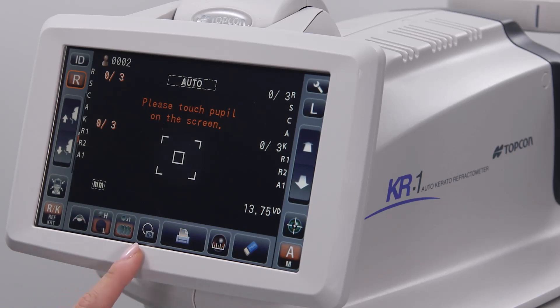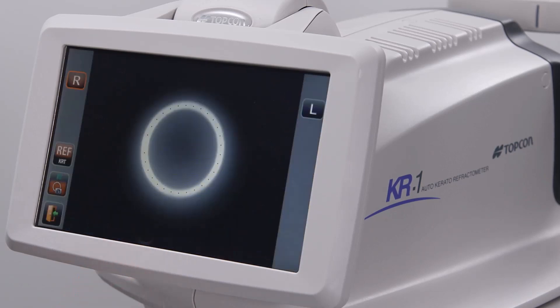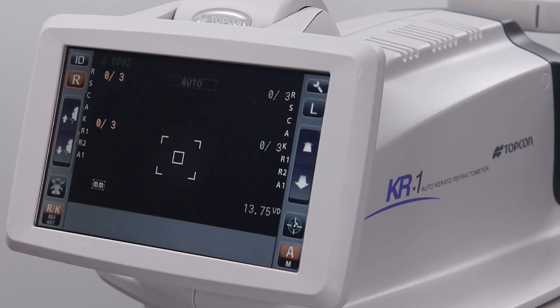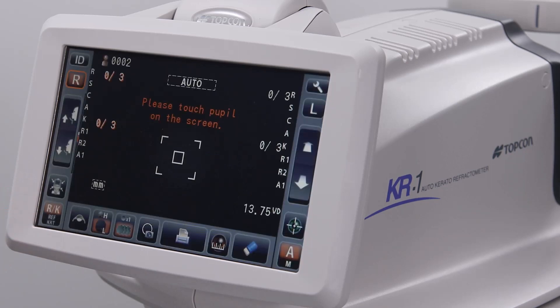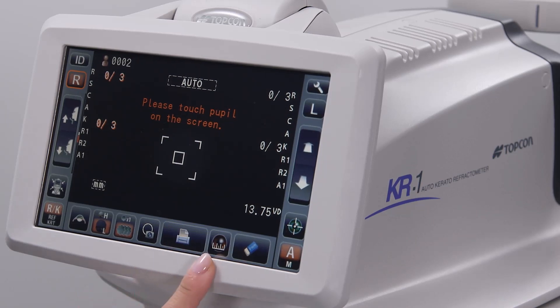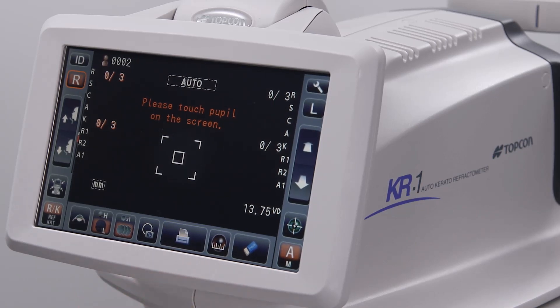The image icon will provide a photo of the eye that was acquired during the testing. The printer icon prints the information that was just acquired on the patient's eyes. The corneal diameter icon provides an image of the eye and an adjustable caliper tool to measure the diameter of the cornea from limbus to limbus.